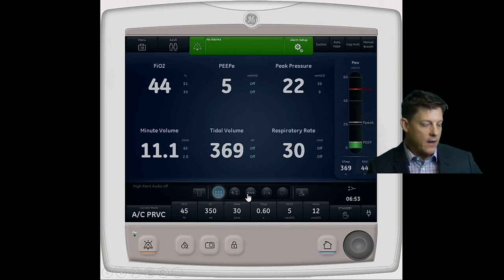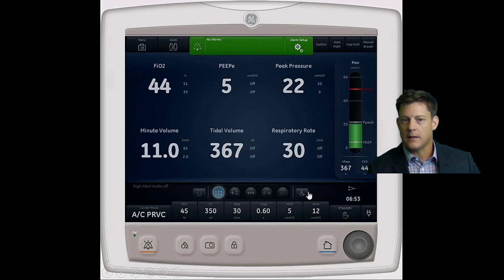If I go back down to my workspaces, this workspace is currently open. That's my present or live patient therapy. To the left here, that's a workspace. It's like a folder that's closed, and that has different views for the past or historical trends. And then if I go to the far right, I see this little square or folder, but we call them workspaces. In this workspace, there are different views related to the future or clinical decision support.